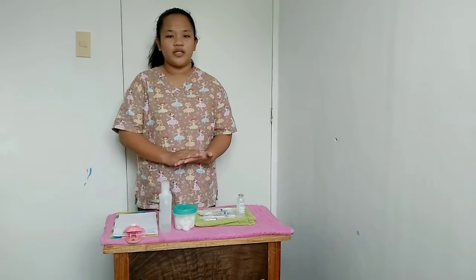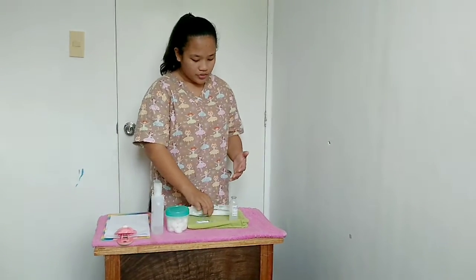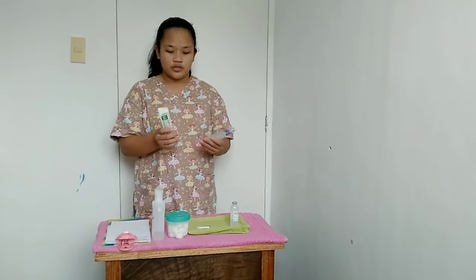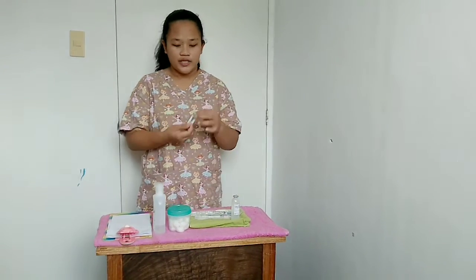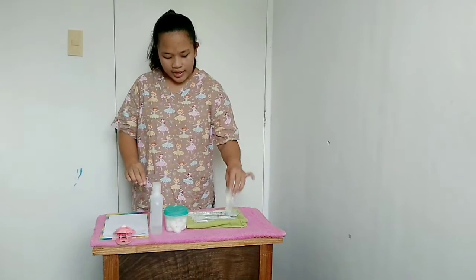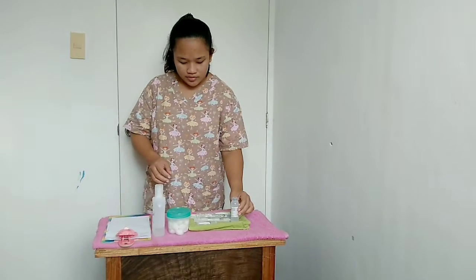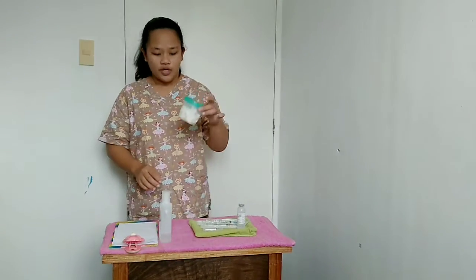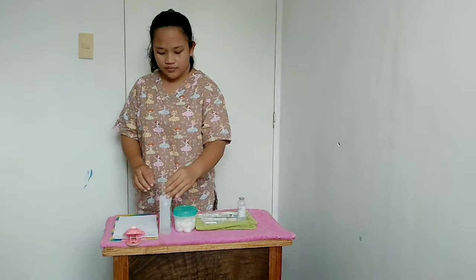To prepare the medication, of course, we need to have a syringe, aspirating needle, sterile water to serve as our medication, cotton balls, and alcohol.